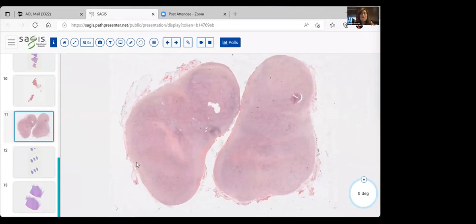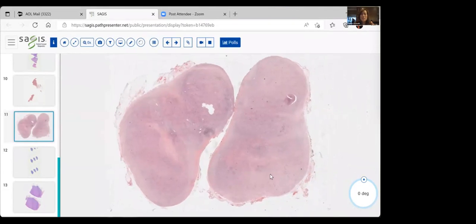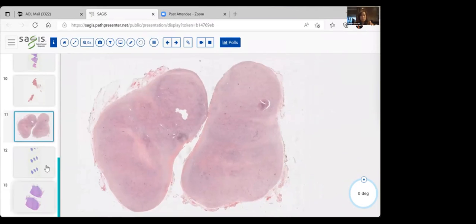So when you have time and you want to say, well, wait, what are these osteoclast-like giant cells of a giant cell tumor of tendon sheath? Just pull this up again and look at this example. I think you'll find it tremendously helpful.